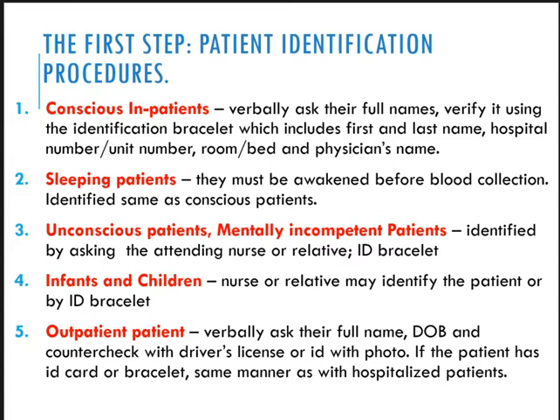Okay, dili wala ni sila na admit sa hospital. So you have to verbally ask their full name. You also have to ask them their date of birth and counter check with driver's license or any ID with their photo on them. Now, if the patient has an ID card or bracelet, same manner as with your inpatients. Okay. Now, take note, guys. Patient identification is the first step in blood collection.